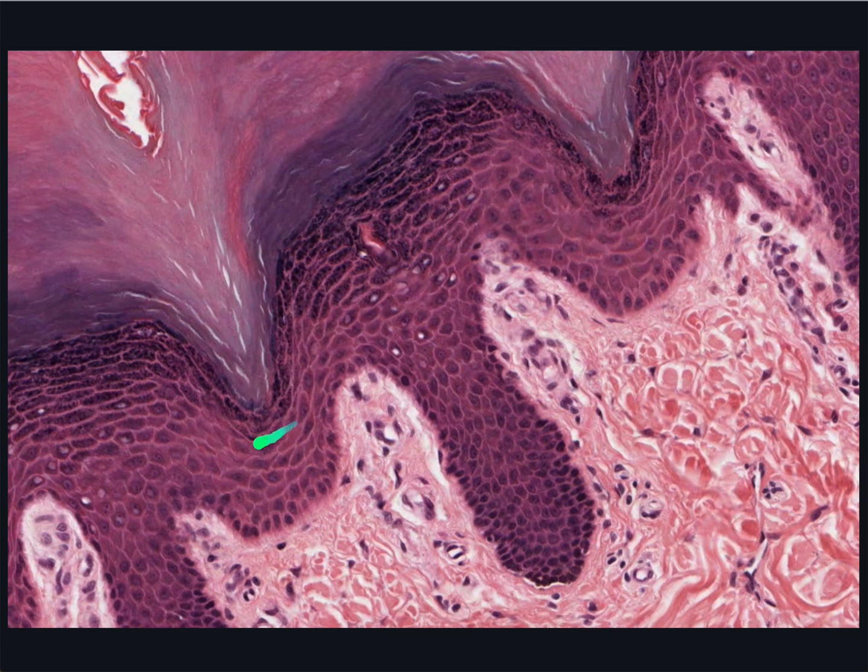When the cells shrink during fixation, their cell walls pull apart from one another, except where they're attached by the desmosomes. So, if you could see more detail in the clear spaces between the cells, you'd see that the cells seem to have spines connecting each other, and are sometimes called prickle cells. So sometimes this layer is called the prickle cell layer.